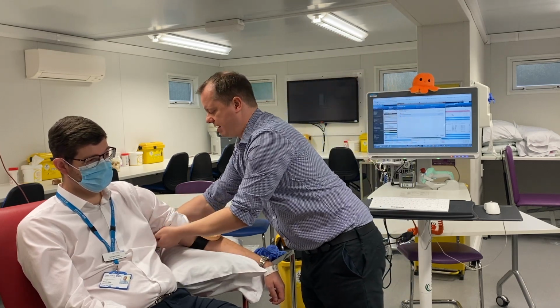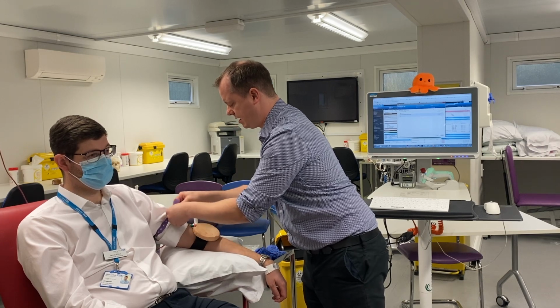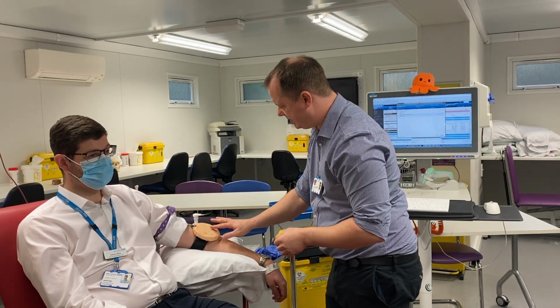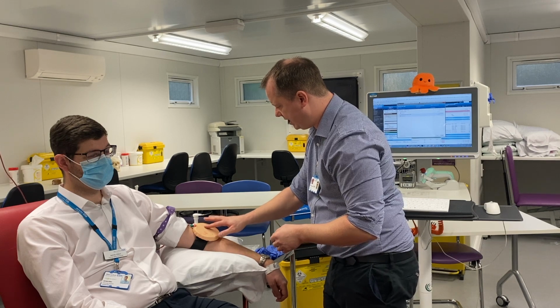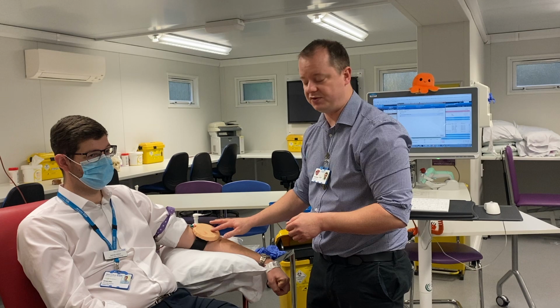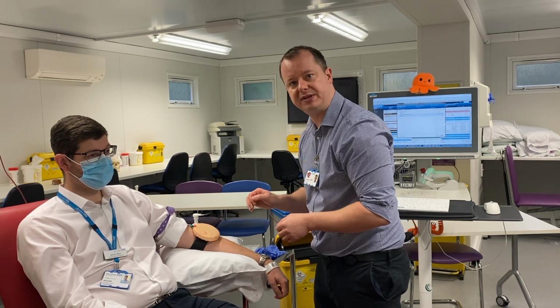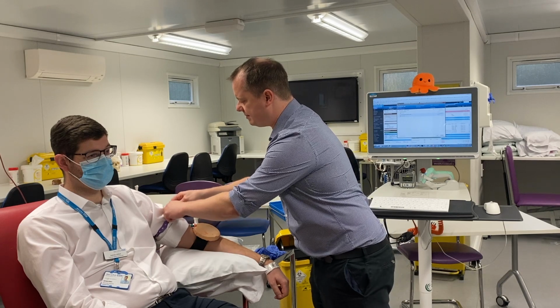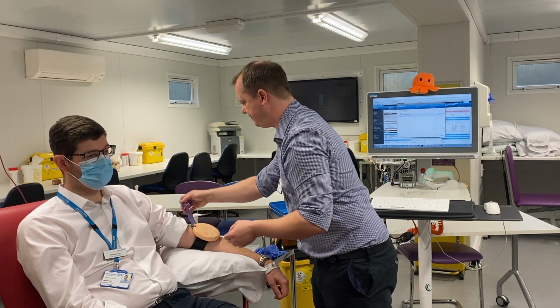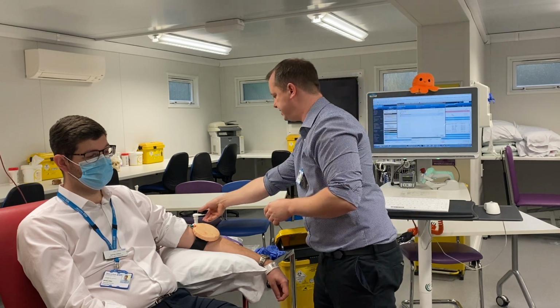I'll wrap that round there now, and I'll see if there are any veins that have come up. I can see here that this vein looks really good. I'll look away, I'll have a good feel. It feels really good compared to the other ones. So this is the vein that I'm going to use, and I know where I'm going to be sticking my needle. Now I can release my tourniquet to give the patient some relief from the pressure of that. And I can now begin to move further with the blood test.